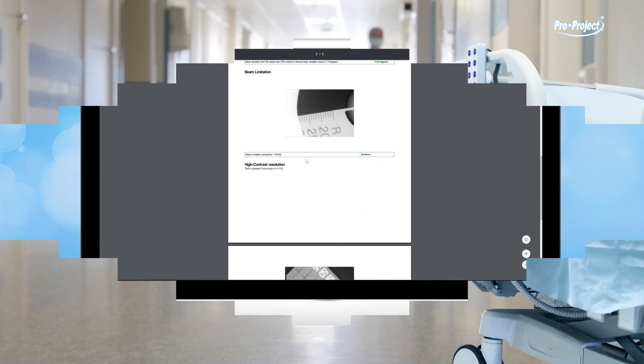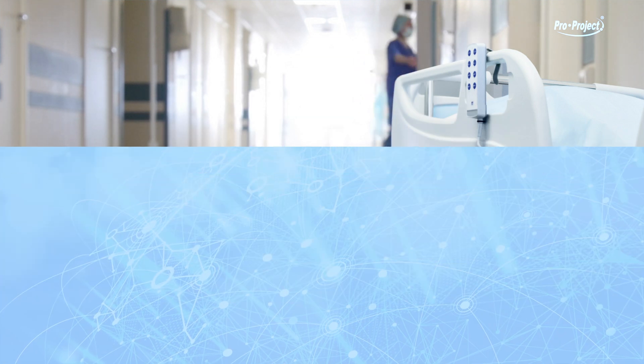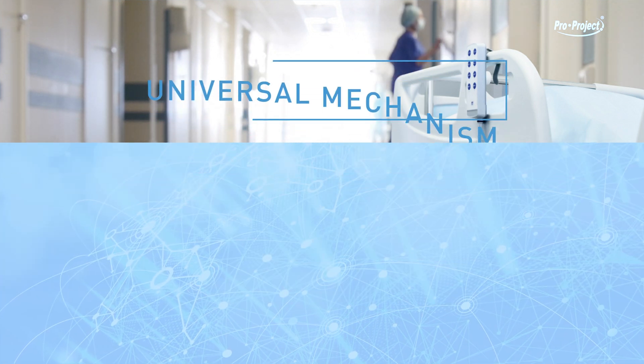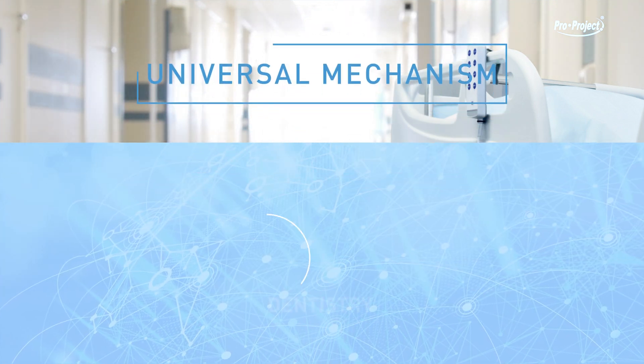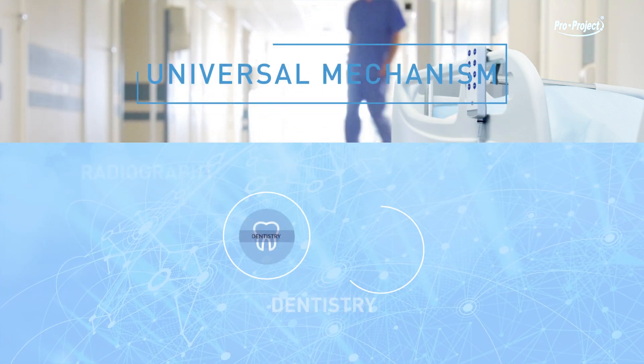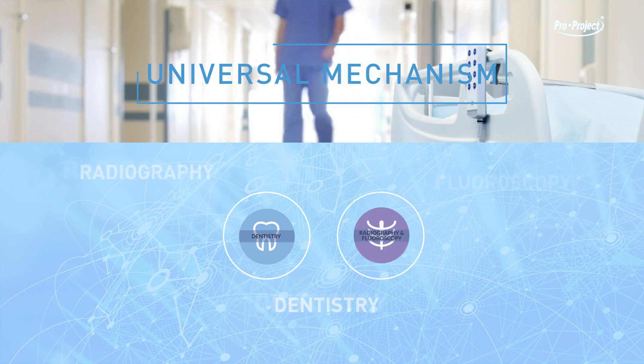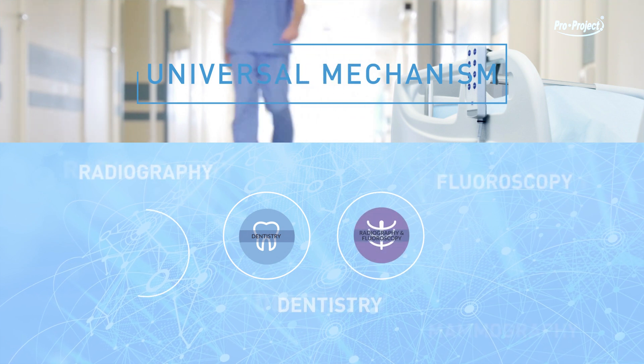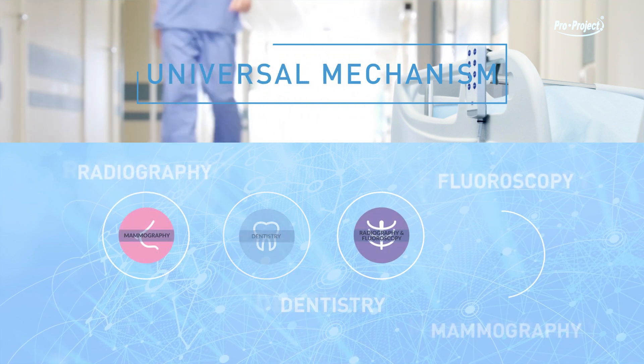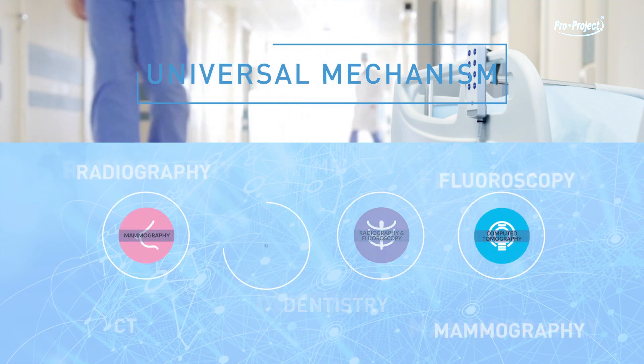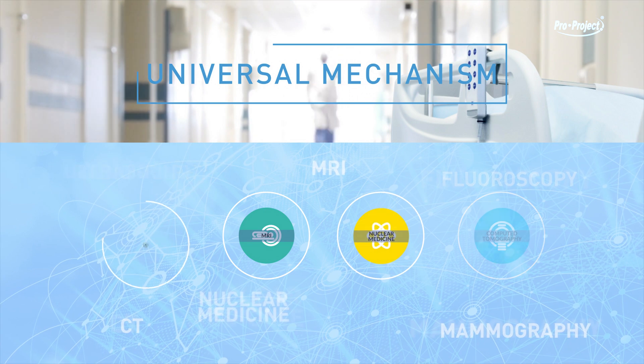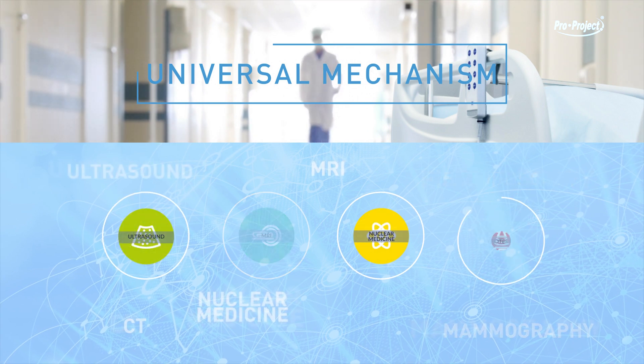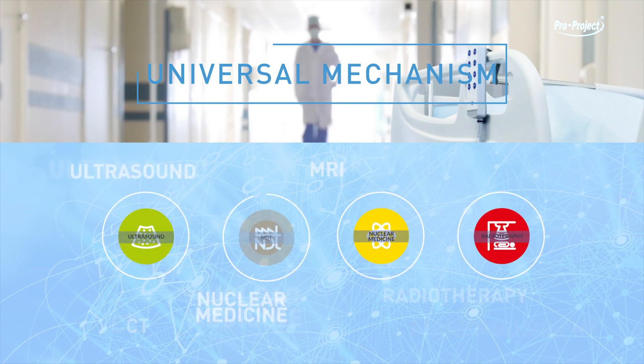This is a universal mechanism, identical for each modality and phantom across the entire system. If you know how to handle one simple dental phantom, you know how to handle all, even in the most complex modalities.